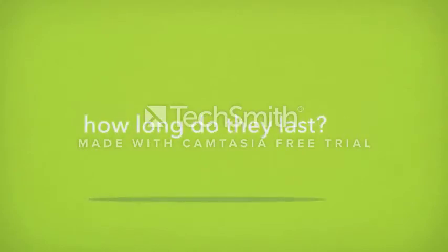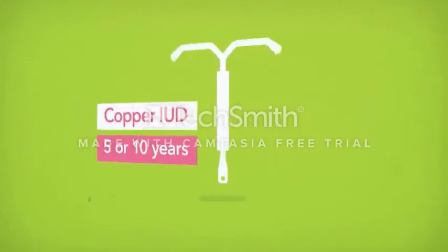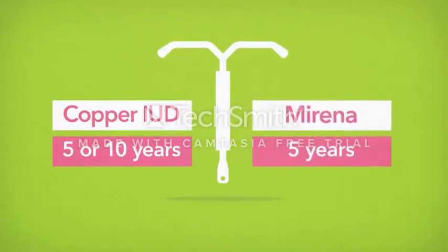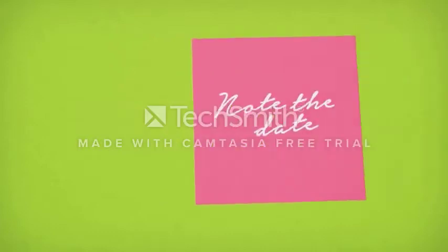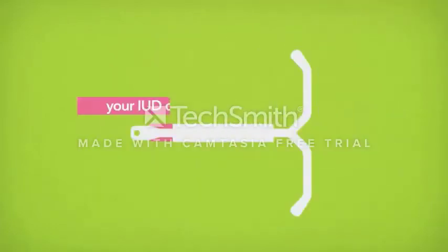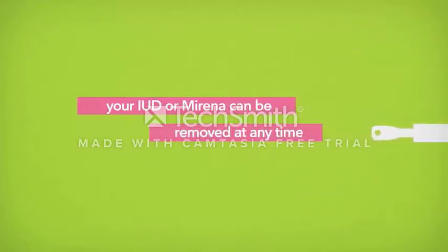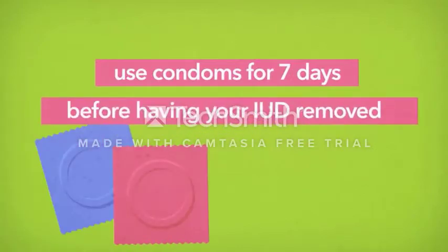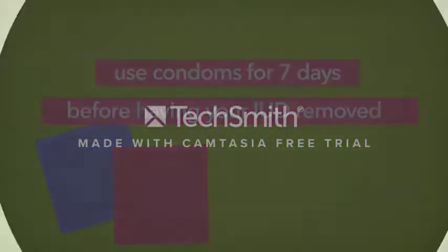How long do they last? The copper IUD will last for 5 or 10 years, depending on which type you have fitted. The Mirena will last for 5 years. We don't send out reminders when your device is due to be changed, so take a note of this date and keep it somewhere safe. You can have your IUD or Mirena removed at any time. We ask that you use condoms for 7 days before having your IUD or Mirena removed or changed.